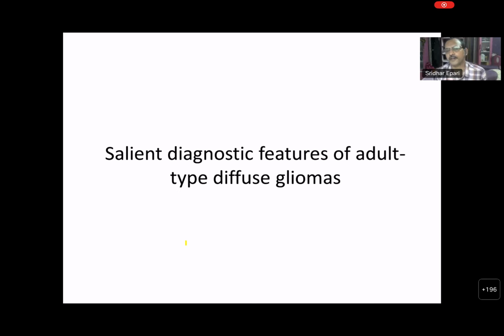So after writing the immunohistochemical finding, you can suffice by saying that this is a P53 mutant phenotype finding, or this is a P53 wild type phenotype finding. The staining pattern is used only as a surrogate for an underlying P53 mutation. Yes, sir. Next one. So we'll go to the next case. I think it will be covered in the subsequent one. Yeah, we can take that.